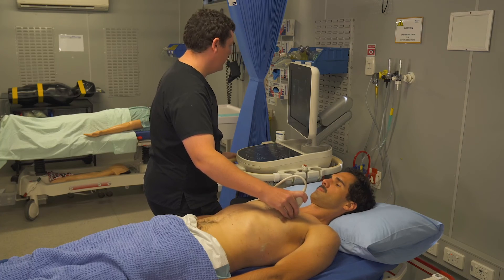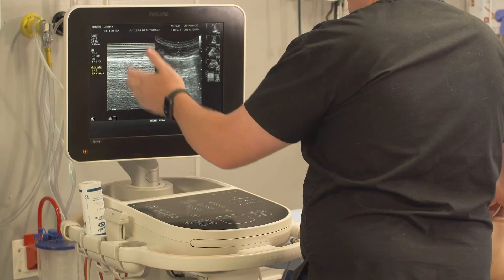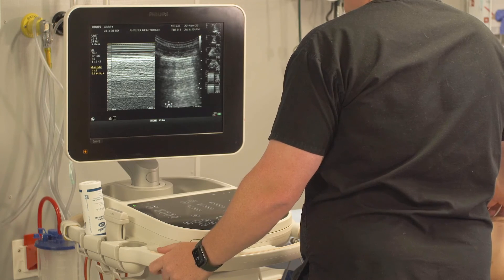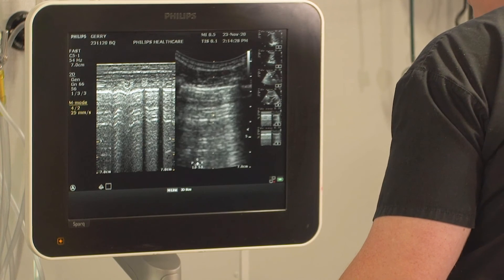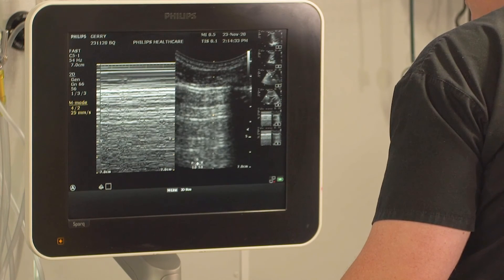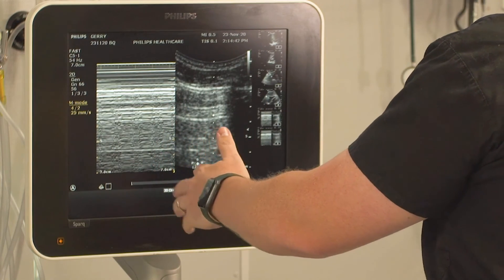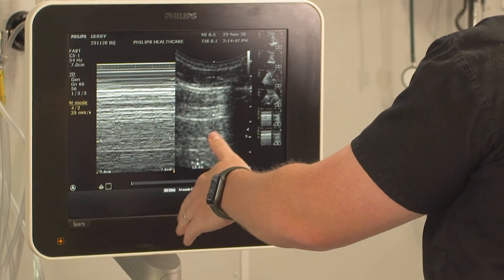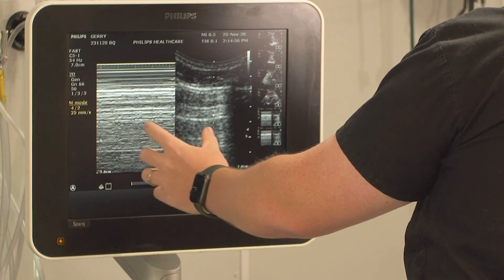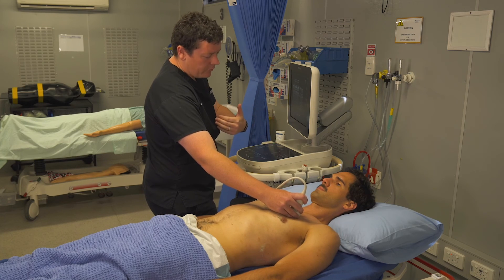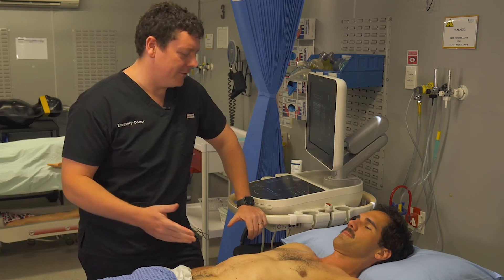Now go to the other side. Optimise the image so you have rib-rib-pleura, and again you can see a beautiful sandy beach — negative for pneumothorax. Have Jerry take a deep breath in and hold it. Even though you can see some movement because he's a young patient, you might think this looks like a pneumothorax due to reduced movement. However, you can still see regular cardiac movement, which means there isn't a pneumothorax. This is also one way to differentiate a right main bronchus intubation — no lung sliding but cardiac movement is still present, which you won't see with a true pneumothorax.